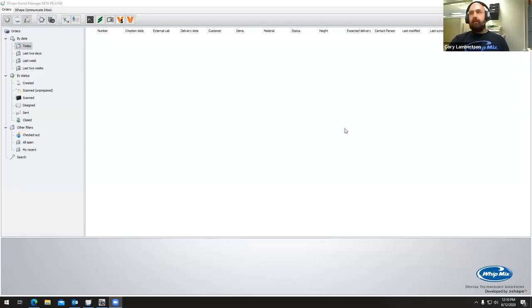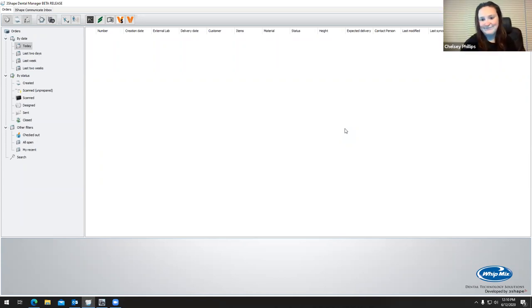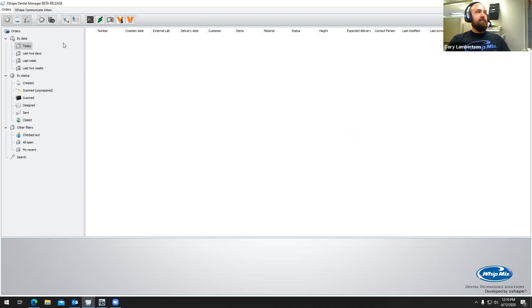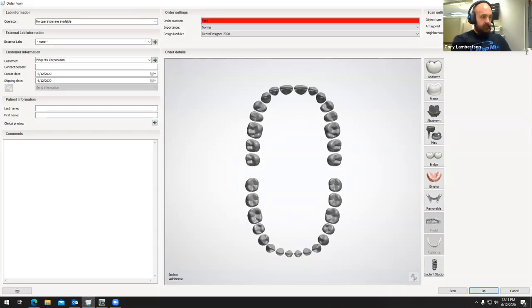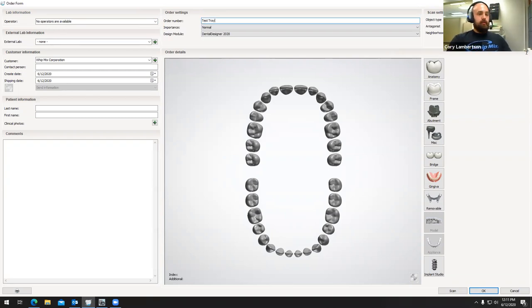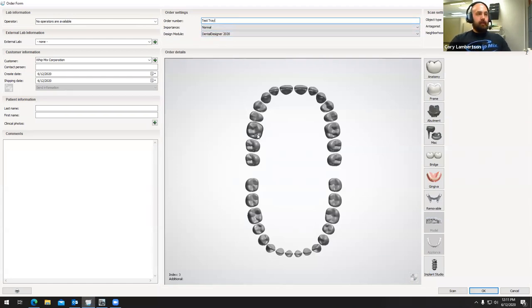Let me go ahead and share my screen. Can you guys see my screen okay? All right. So to begin, just like anything else in 3Shape, we are using the 2020 3Shape beta release. To create a new order, we're going to click on the top left where the blank sheet of paper is, and we're going to name it. I'm going to name this 'test tray.' From here, we're going to select a tooth on the arch that the tray belongs to — this is a lower arch — so I'll select a tooth on the lower arch.